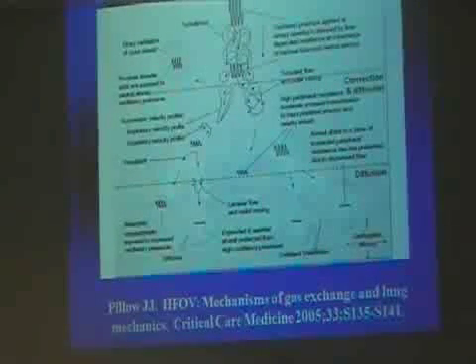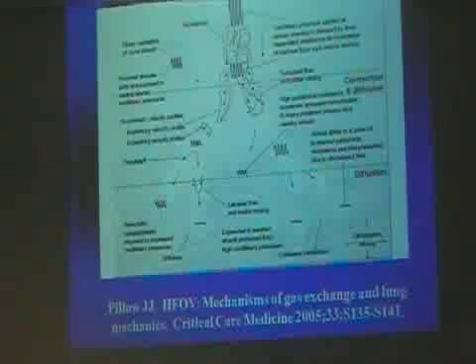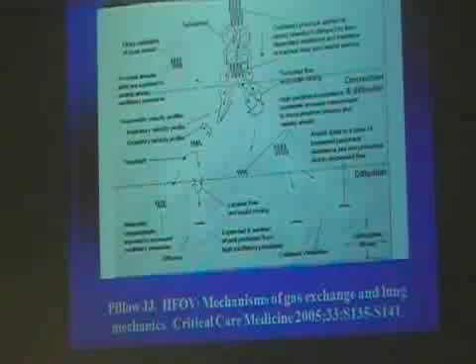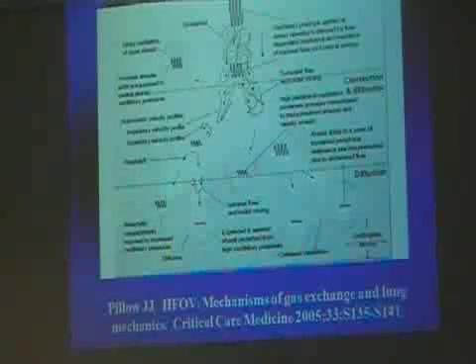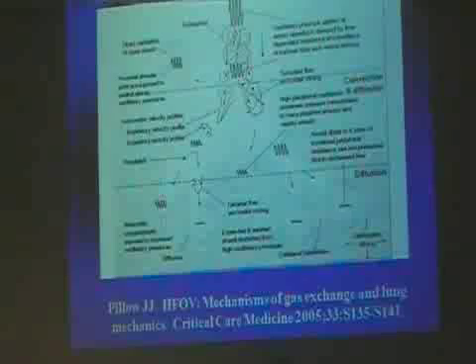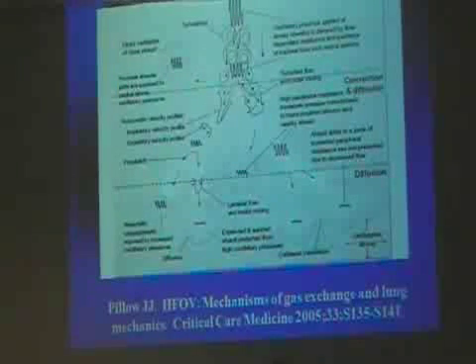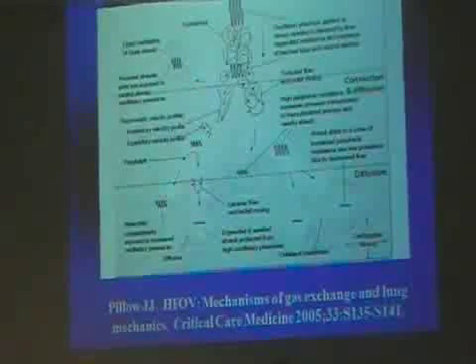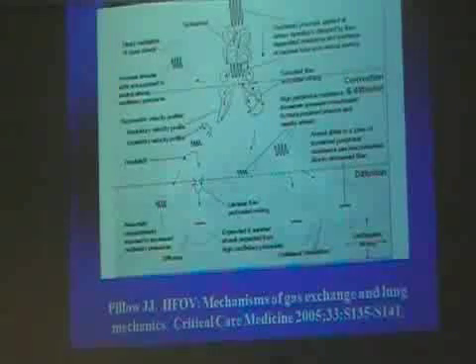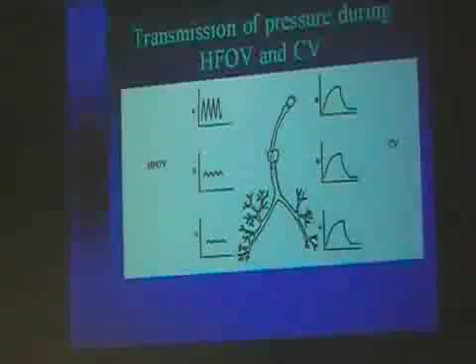What I want you to see is that there are many things going on that don't go on very much during conventional ventilation that affect the movement of gas at high frequencies. All right, lots and lots of stuff is happening that is going to mix the flow of gas and allow CO2 to be removed. And if you're interested, I highly recommend this, and I've got some other articles you can look at. This is very good. Everybody should review it.